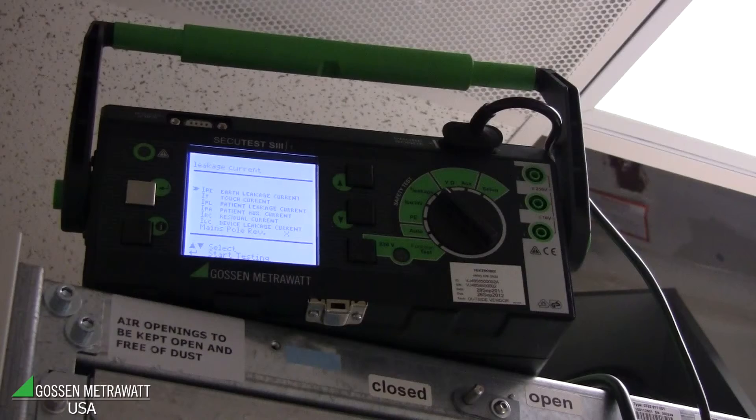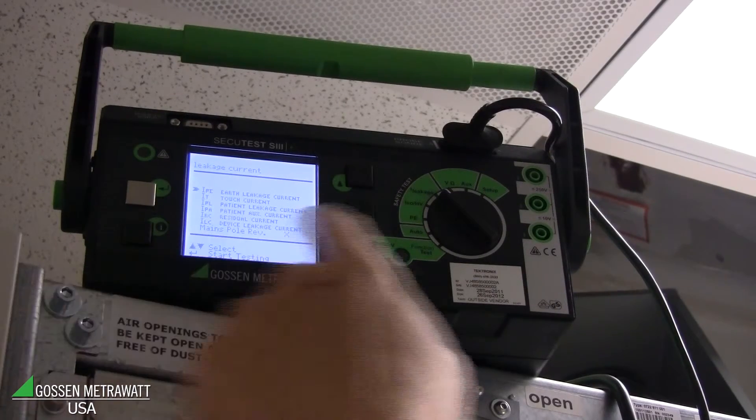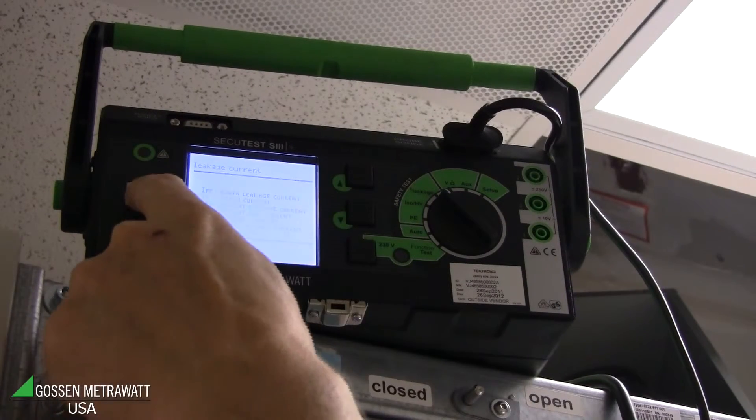The next test is a leakage current test, done in a similar way to the insulation resistance test. We connect one probe to the ground of the building and the other probe to the Philips equipment, then power it on and measure the leakage current between these two points. Everything is connected, we start the measurement and push the button for touch current — the tester asks to switch on the equipment, which is already on.